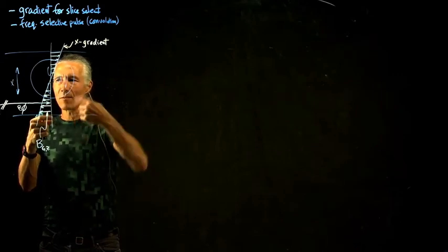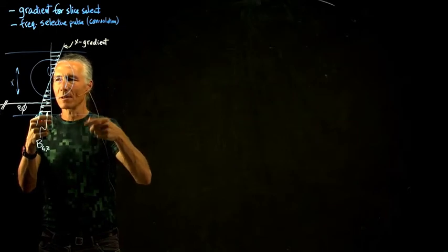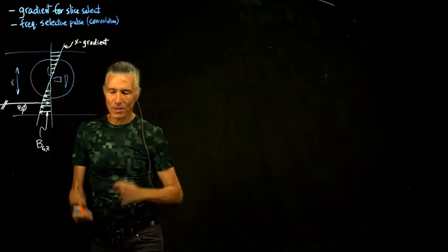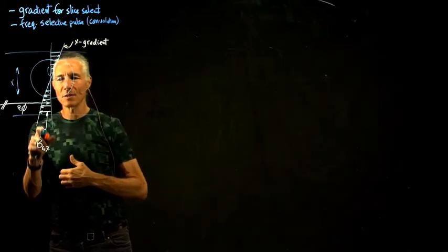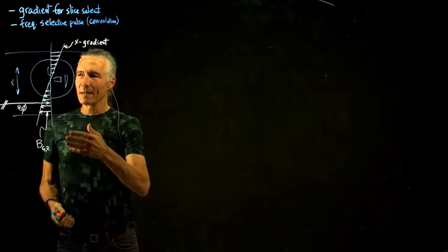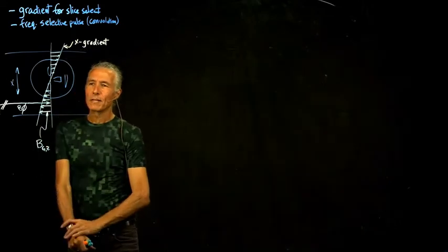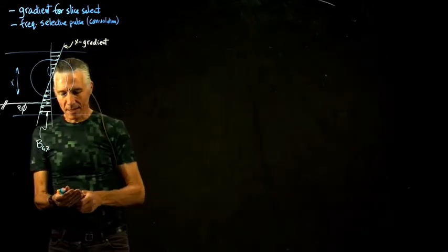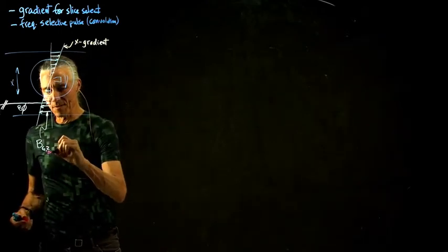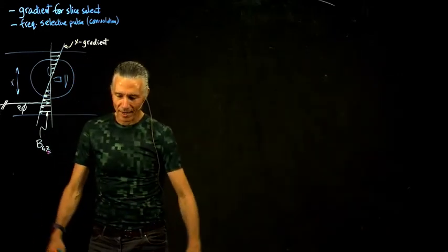So remember, the X and Y components are rapidly changing 100 million times a second with the RF coil, but the gradients can't change anywhere close to that. They're changing 1,000 times a second, and so you can basically ignore the X and the Y component caused by the gradient. You're really only interested in this one here, which is the Z component of the B field that the gradient adds or subtracts.